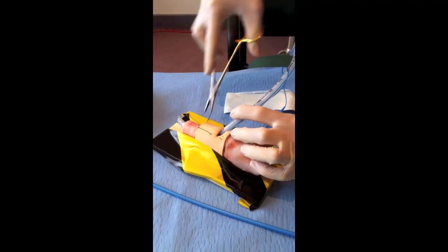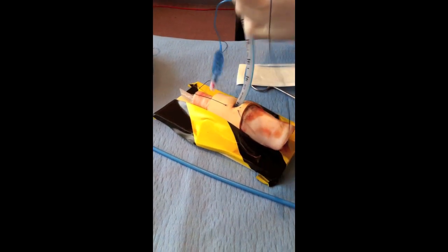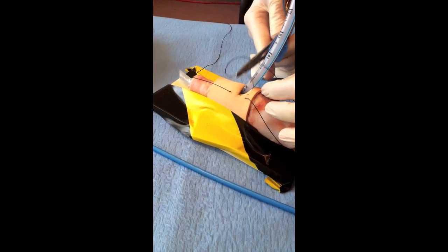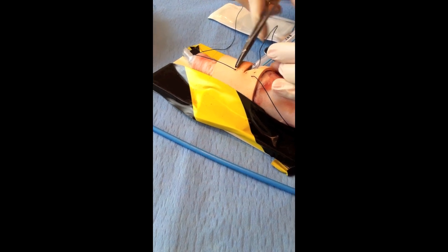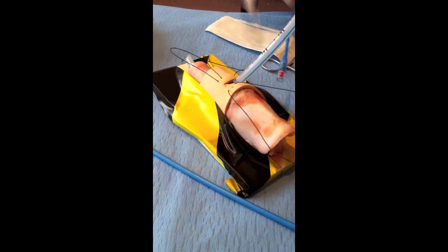Nice big bite that side. Mattress stitch — I'll go the other way. Nice big bite that side. I want a nice big loop here, so I'm going to go far from my entry point there, all the way over here — a nice big loop.